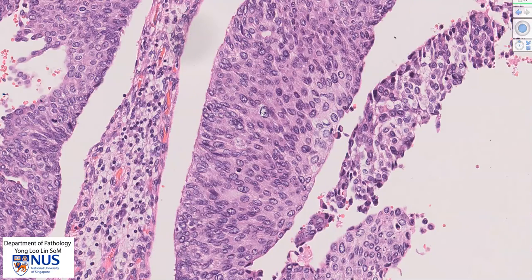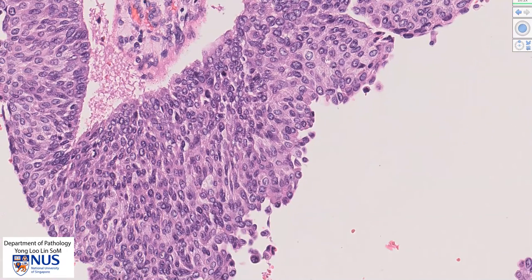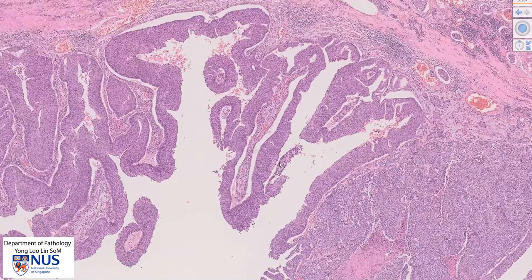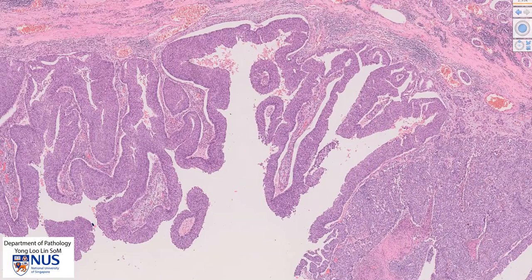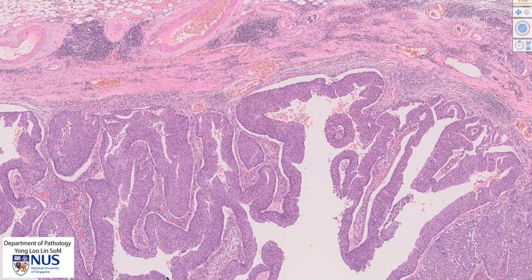Over here, we can see quite a significant variation in nuclear size. For example, this large irregular nucleus is significantly larger than this nucleus, so there is a moderate degree of nuclear pleomorphism. There is also disorganization of the urothelium. If the whole tumor were composed of these papillary areas without any obvious invasion into the stroma, this would be called papillary urothelial carcinoma, non-invasive.